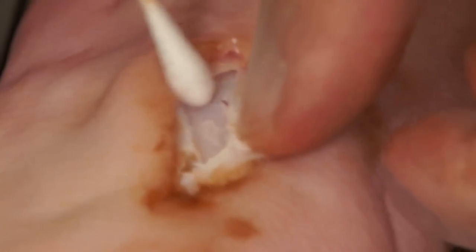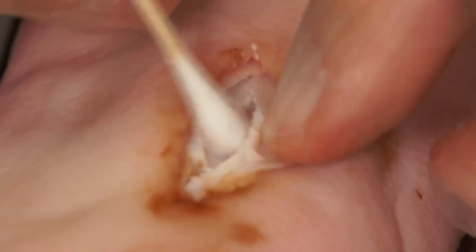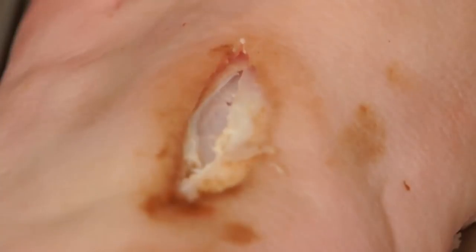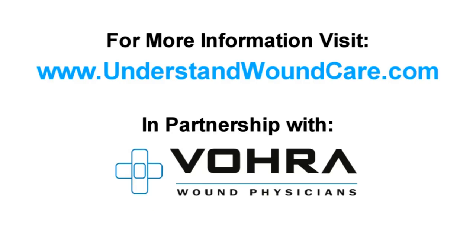When performing a debridement, commonly skin and subcutaneous tissues are removed in a necrotic area. In addition, the fascial plane may be removed and necrotic tissue may be removed from the muscle level as well.